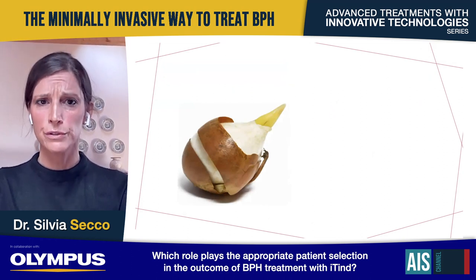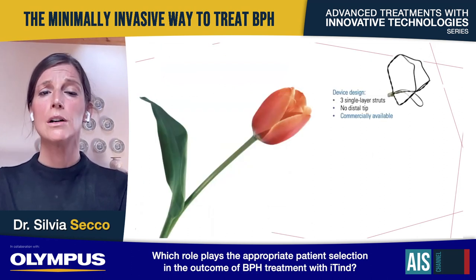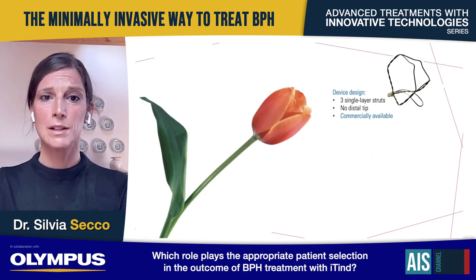So the first device generation has been improved to the second one. I really love flowers, and seeing iTind, a tulip always comes to my mind. Look at this shape. In fact, the second generation has three single layer struts, no distal tip, and this is the one that is now commercially available.